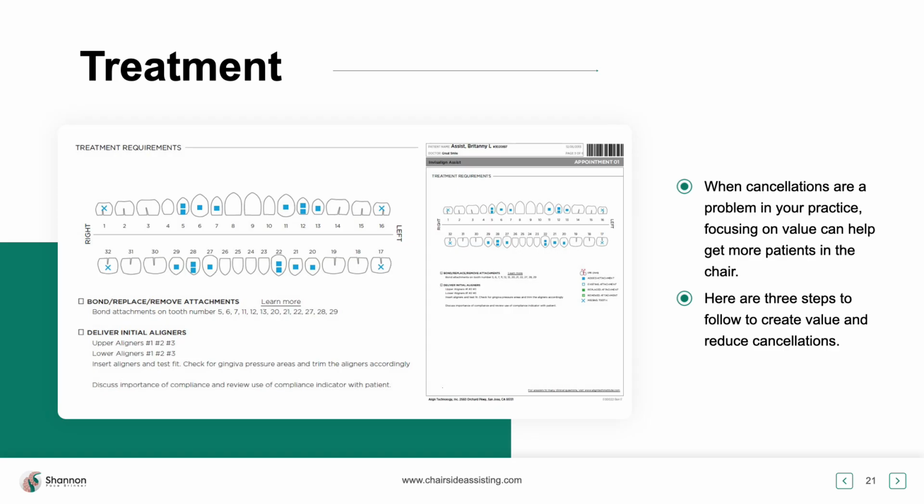Instead of waiting till the end to celebrate, what we find is we have better compliance. We get more patients doing aligner therapy and doing what they should because they're using their aligner for whitening. It is really one of the best ways to do whitening, again, right out of the gate.